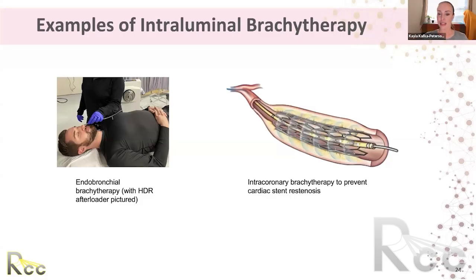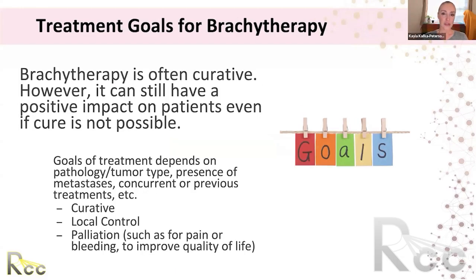It can actually help prevent stent restenosis, and some centers are starting to do this as well. So an interesting non-cancerous reason for brachytherapy. So treatment goals for brachytherapy, it is often curative, but it depends what we're treating. It can still have a positive impact on patients, even if we can't cure them, such as in palliative cases.